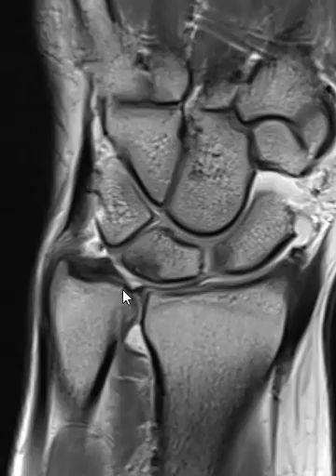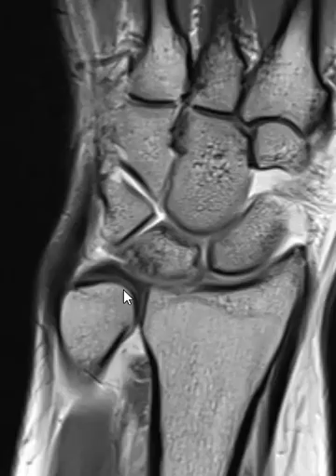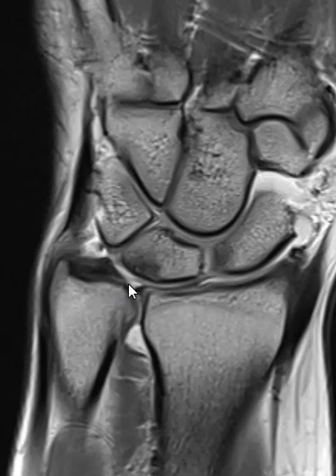We call this ulnar abutment syndrome — a classic case of ulnar abutment syndrome with a TFCC tear. Everything else looks pretty good. Thank you very much.